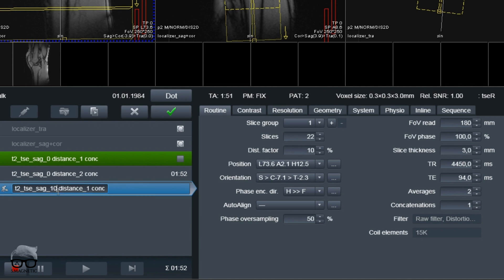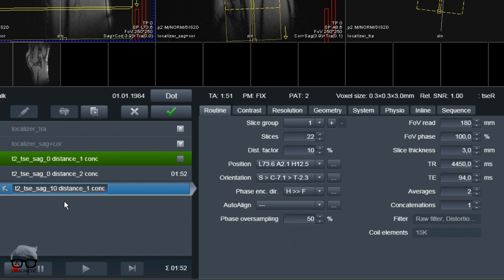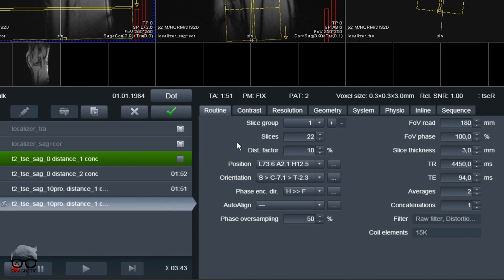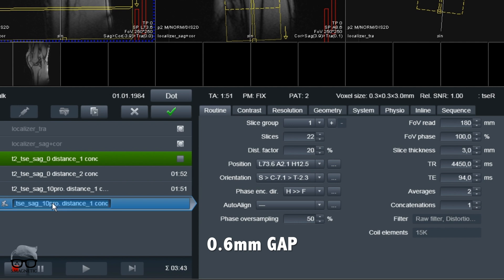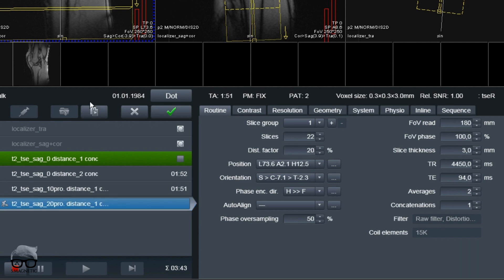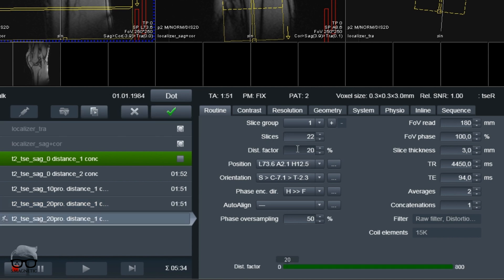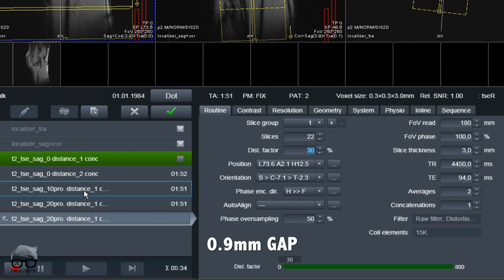The next test is increasing to 10% distance factor with one concatenation. With a 3mm slice thickness, 10% is around 0.3mm distance factor, meaning you lose information about 0.3mm between those slices. Next we increase to 20%, which is approximately 0.6mm — so we lose anything in between those slices at 0.6mm. The last one is 30%, which is approximately 0.9mm.